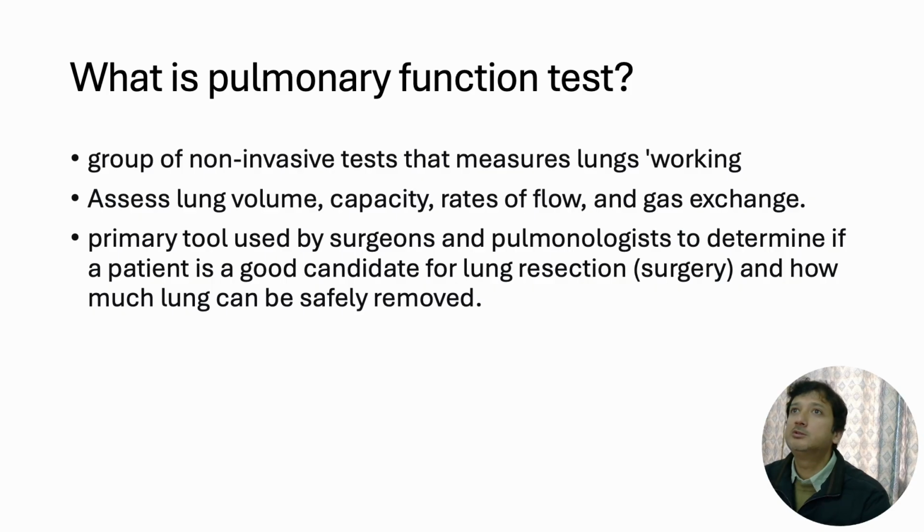It is a primary tool which is used by surgeons and pulmonologists to determine if a patient is a good candidate for lung resection or surgery and how much lung can be safely removed.